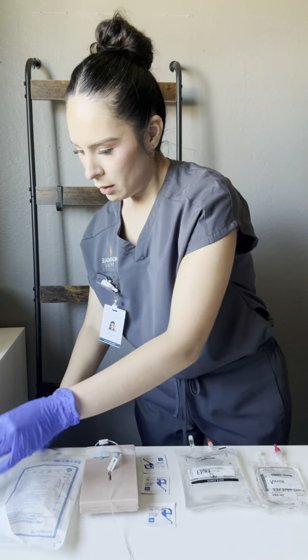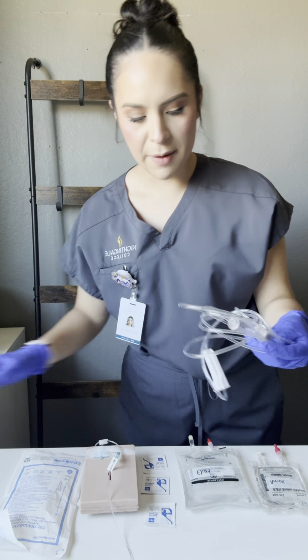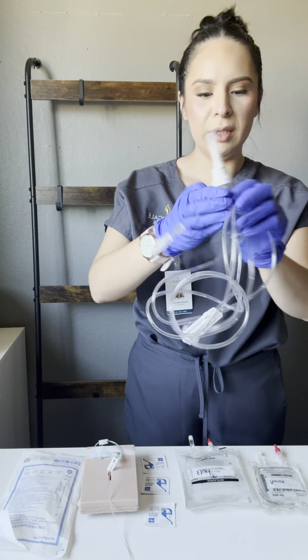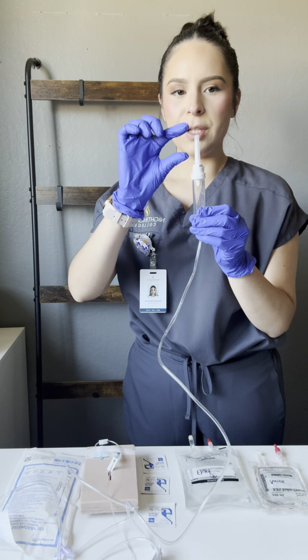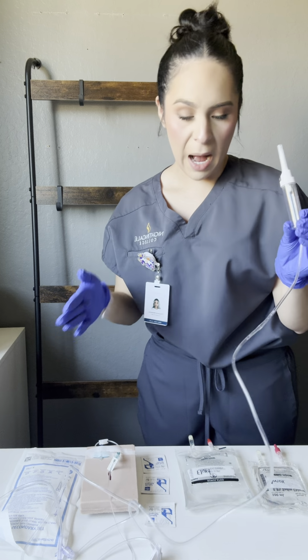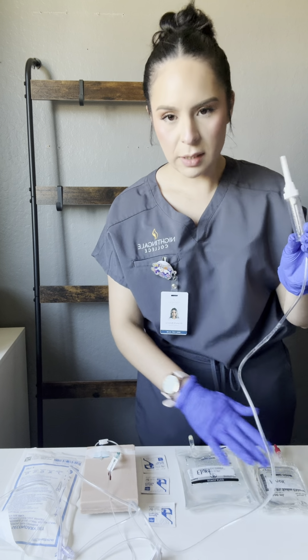So I'm going to open up my primary tubing set and then go over the different parts of the tubing. This part here is called a spike end. It's what we use to spike our bags, such as our fluid and our amoxicillin.